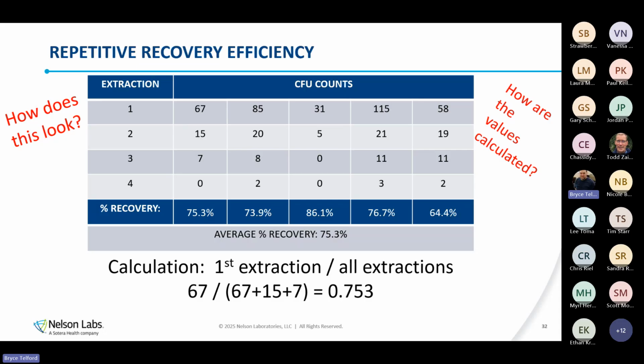So I'm going to again open it up, and you can unmute your microphones. What do you think would happen? What should we do if I'm just seeing the same numbers continuing down? If I'm seeing 67, 67, 67, 67, what could be causing that, and what should we potentially do? Any ideas? No brave souls?